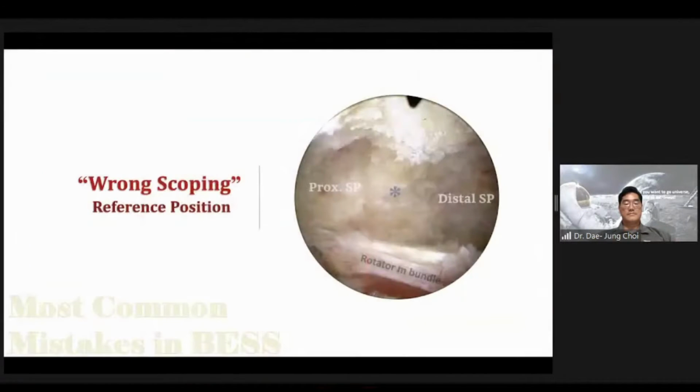Sometimes, before we are familiar with endoscopic anatomy and when you have few reference anatomies in the endoscopic view, you can easily lose your way and fall into panic and disorientation, spending about 1 or 2 hours in the interlaminar space outside, even without starting the main procedure.